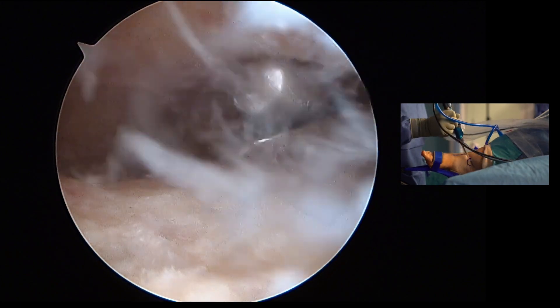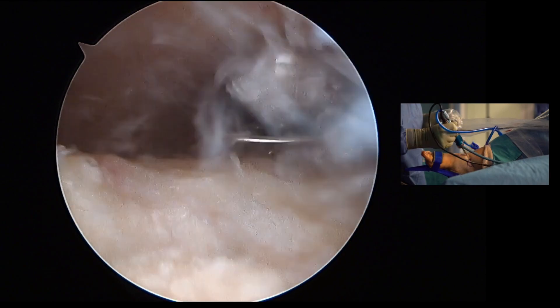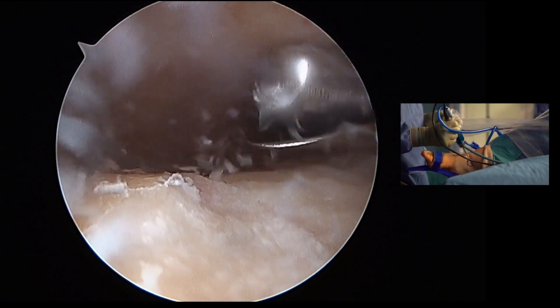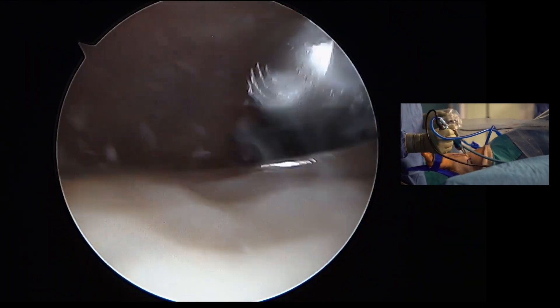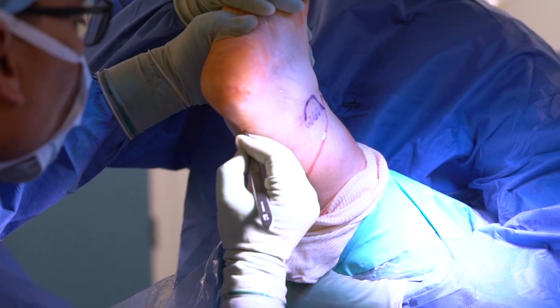The final instrument for this operation is the burr — the most powerful burr. The joint is prepared down to the subchondral surface with bleeding bone, completing the joint preparation.